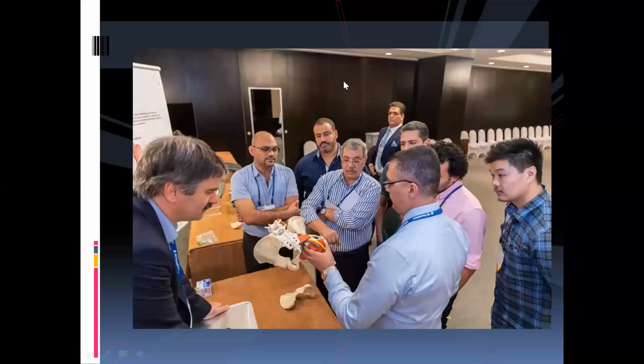We may increase this 50% of the attachment. That's why we do grafting inside the medial wall, in order to augment this defect, as well as to allow osteointegration in case of a cementless cup, or interdigitation of the cement.